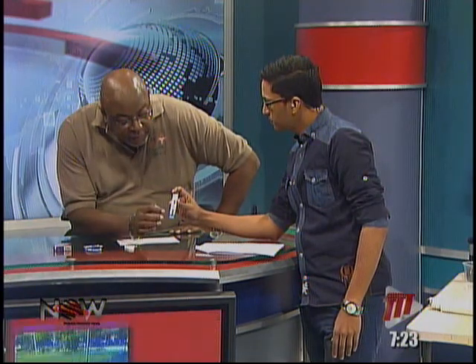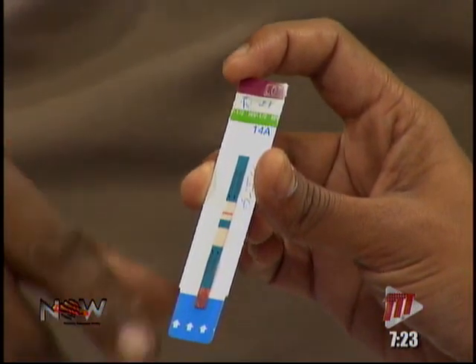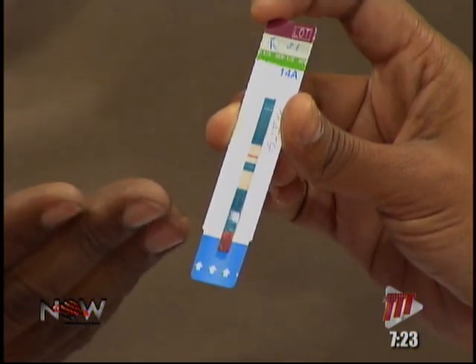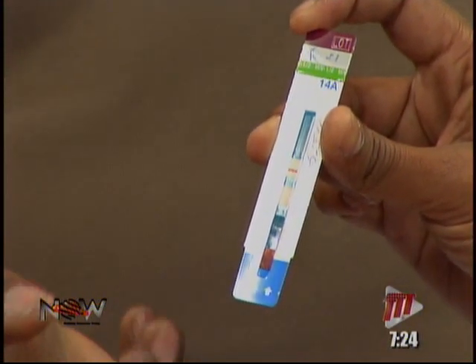The blood is placed, and there are antigen on the stick. So when we use the determine buffer, it carries the HIV antibodies along the strip, and when it passes over the part that has the antigen, it sticks onto the HIV antibodies, producing a change. Right, and we saw 1 line, which means negative. If there's 2 lines, it's positive. And then there was this one as well.